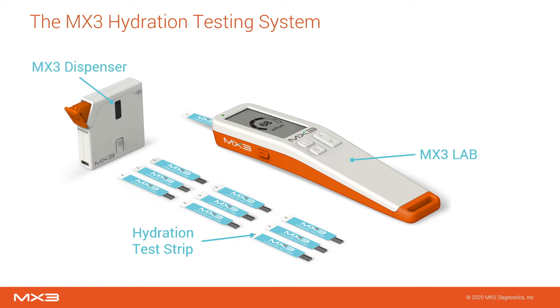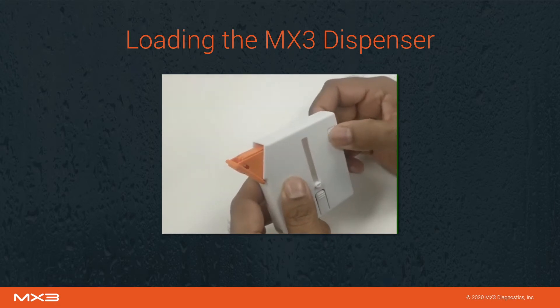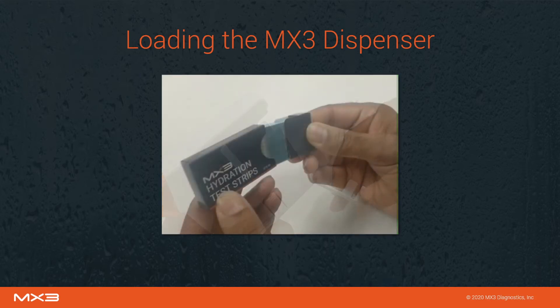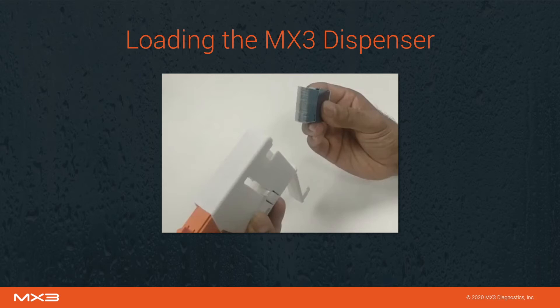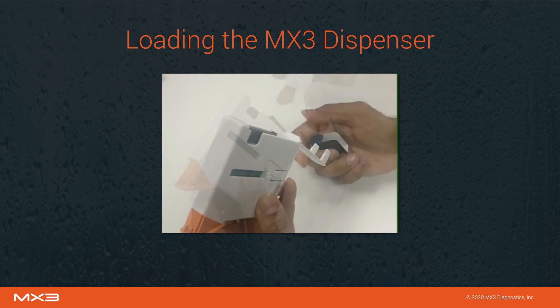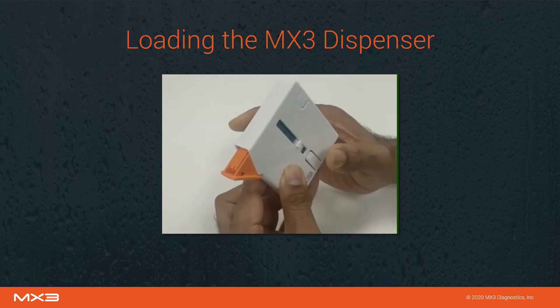The test strip dispenser is used to minimize the manual handling of strips. The dispenser holds up to 40 hydration test strips. To load the dispenser, first push down the spring until it locks, then open the dispenser. Open a new packet of test strips and slide the inner sleeve out, keeping the base tilted up to prevent strips from sliding out. Insert the test strips and tilt the dispenser, allowing test strips to slide in. Lastly, close the dispenser and push the tabs to release the spring.